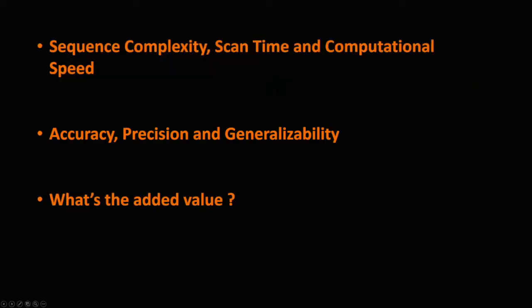In summary, there are three critical points. First of all, an MR fingerprinting scan involves scan design, dictionary simulation, and template matching, which are more complicated than the current MR scans implemented on the scanner.